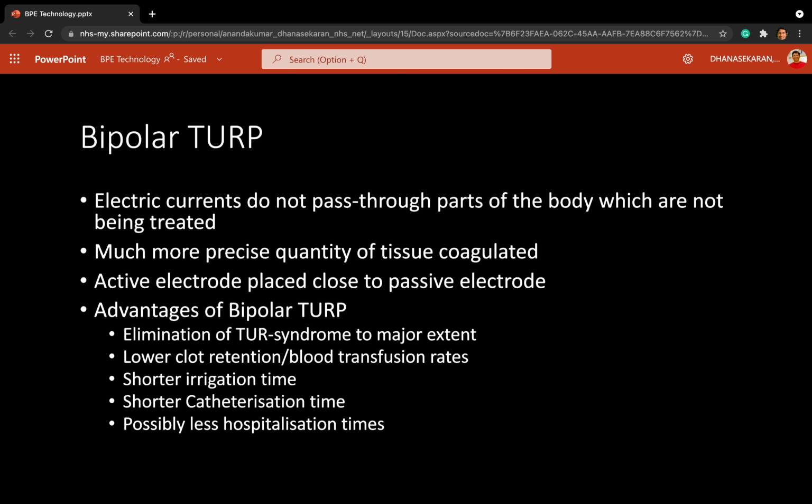Yeah. But if the surgeon is doing a good job with monopolar, I think they can achieve the same outcome. So the main advantage, as you said, is it's good for people with defibrillators or pacemakers, foreign bodies, and we just want to keep the current within that loop area. But having said that, even with bipolar TURP, if you do resection for more than 60 or 90 minutes, it can cause TUR syndrome, because TUR syndrome is not just the hyponatremia, it's also fluid overload.